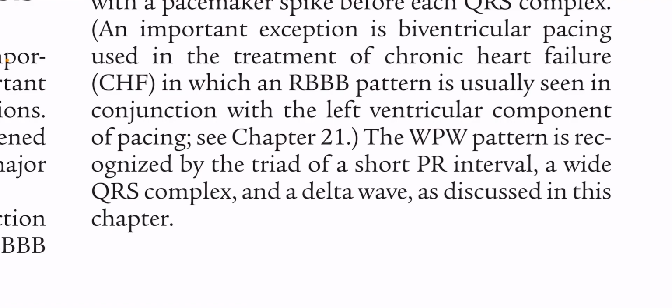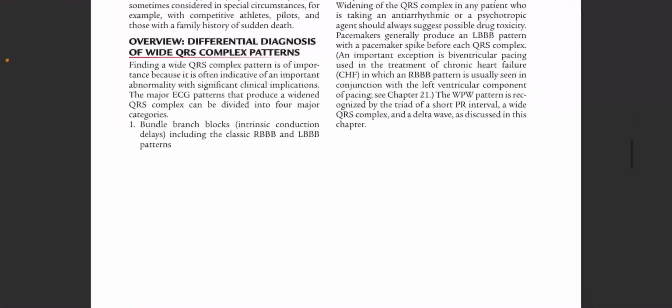The WPW pattern is recognized by the triad of a short PR interval, a wide QRS complex, and a delta wave, as discussed in this chapter.